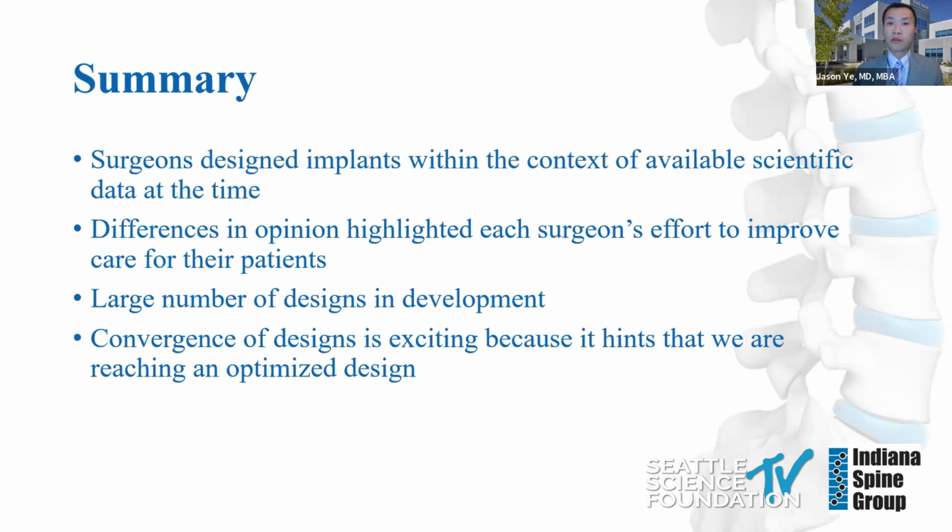The average age of an arthroplasty patient in the IDE trials was about 40. As we continue to innovate, we should aim for an ideal disc replacement implant to perform well for 40 to 50 years.